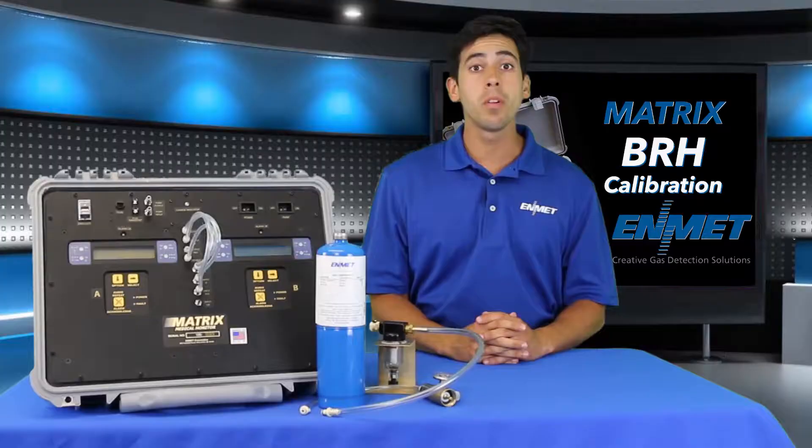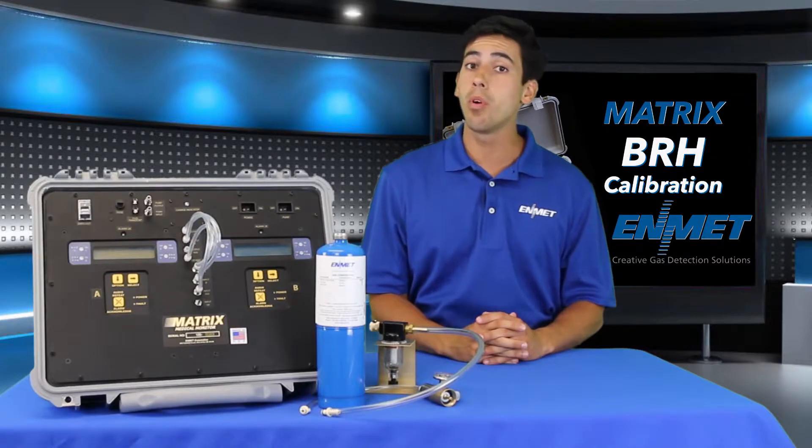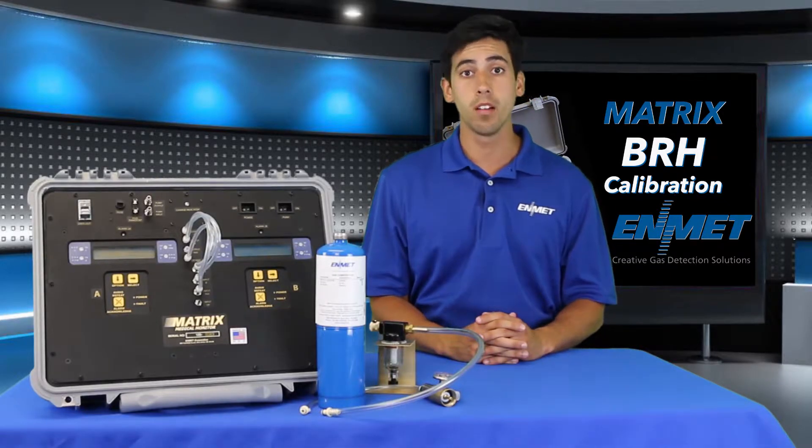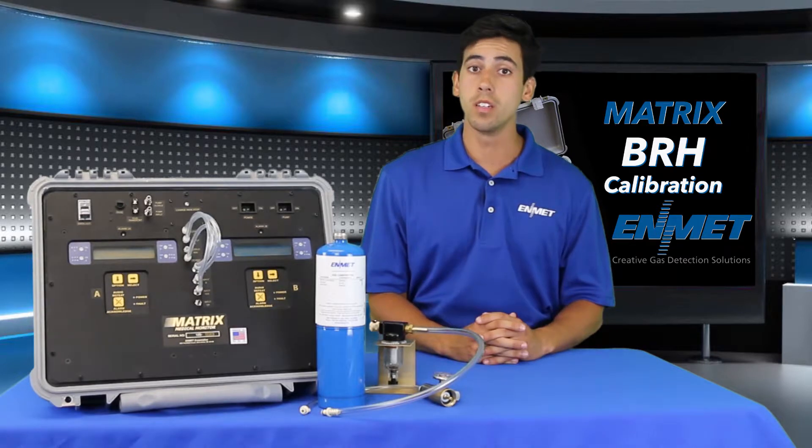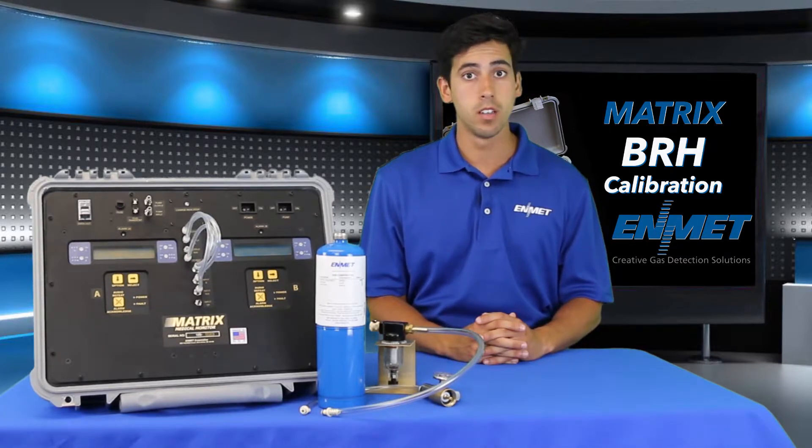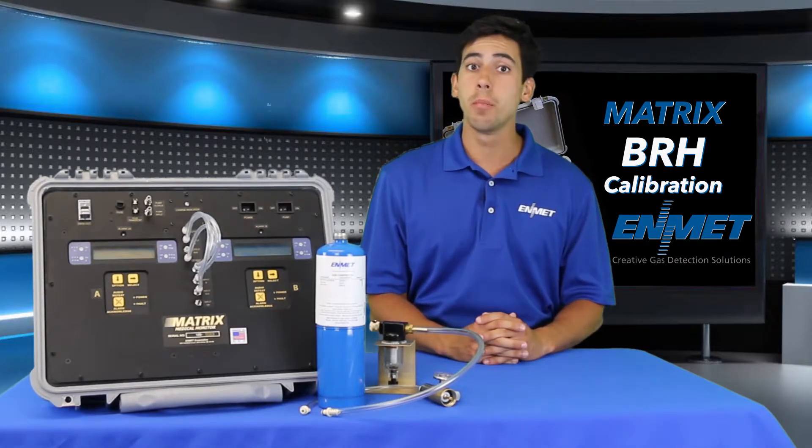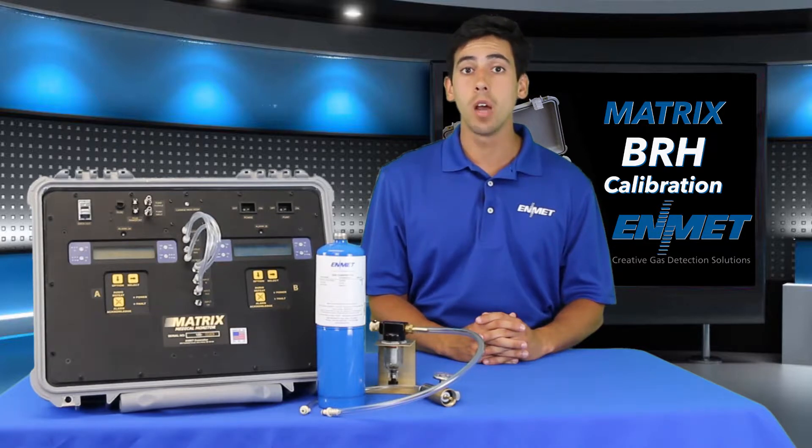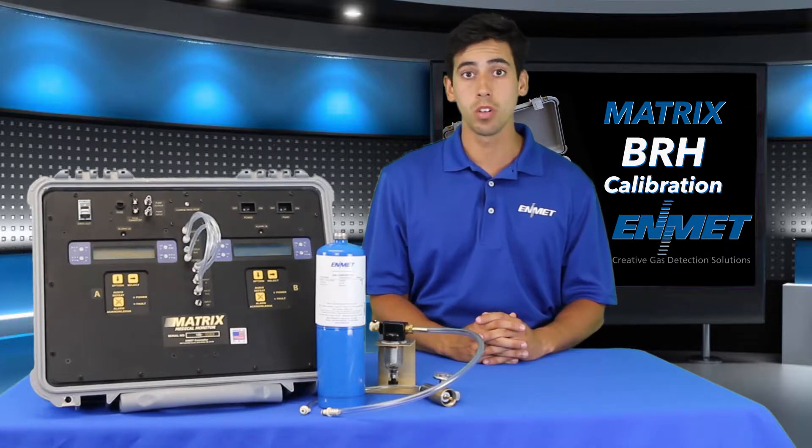You need to attach the bubbler assembly between the input port A and the compressed air line which must be regulated to half a liter per minute. Alternatively, if your matrix is supplied with an onboard sampling pump, this may also be used as your supplied air source.